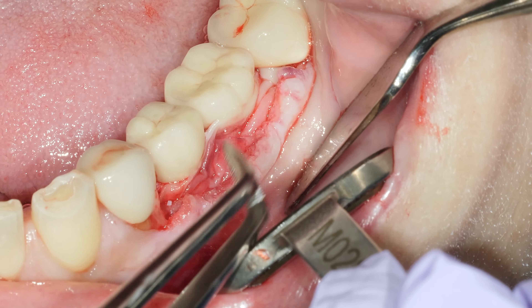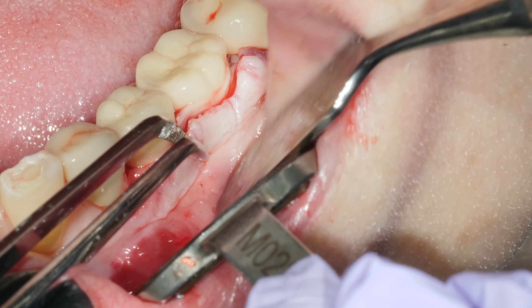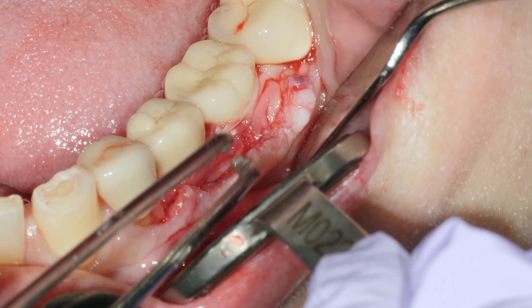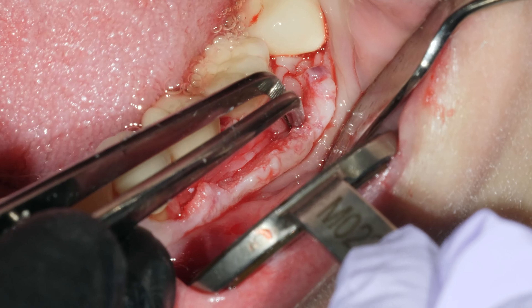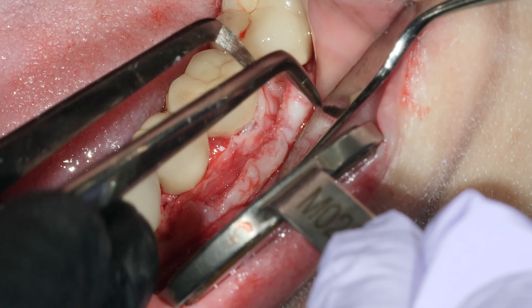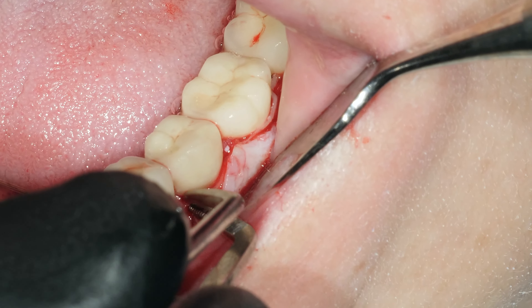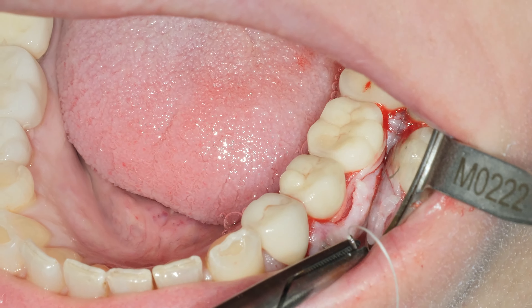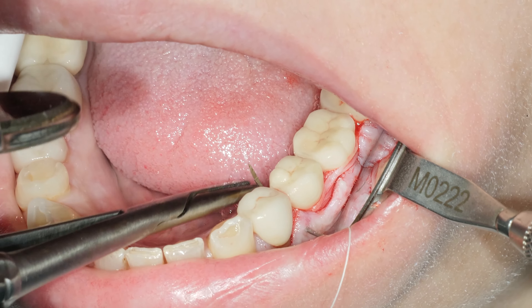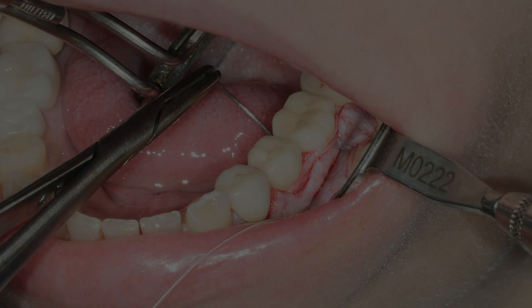In this case I am tucking this membrane into the fold and entering the interdental area, or inter-implant area. Nice adaptation. We then use some polyvicryl suture.